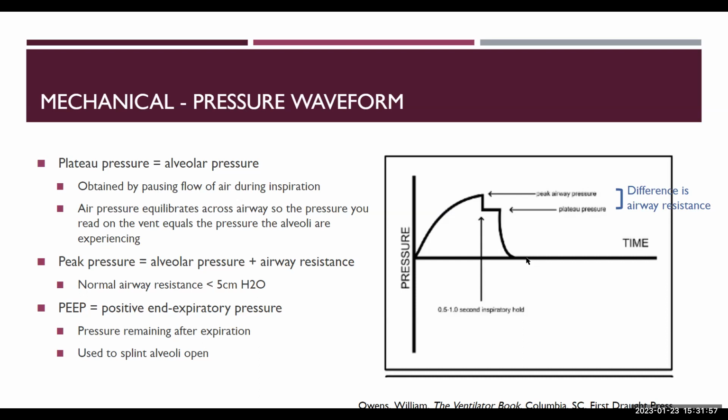Just wanted to point out that the plateau pressure is an active measurement. So you as the clinician have to interact. You have to do something to obtain this pressure. Whereas peak pressure is being reported for every single breath, even by ventilators from the 1980s. It's very easy to measure because it doesn't involve doing anything to the patient. As long as the tidal changes in the pressure happen, the monitor and the ventilator would record it and report it for you. So it's much more frequent to see a peak pressure.